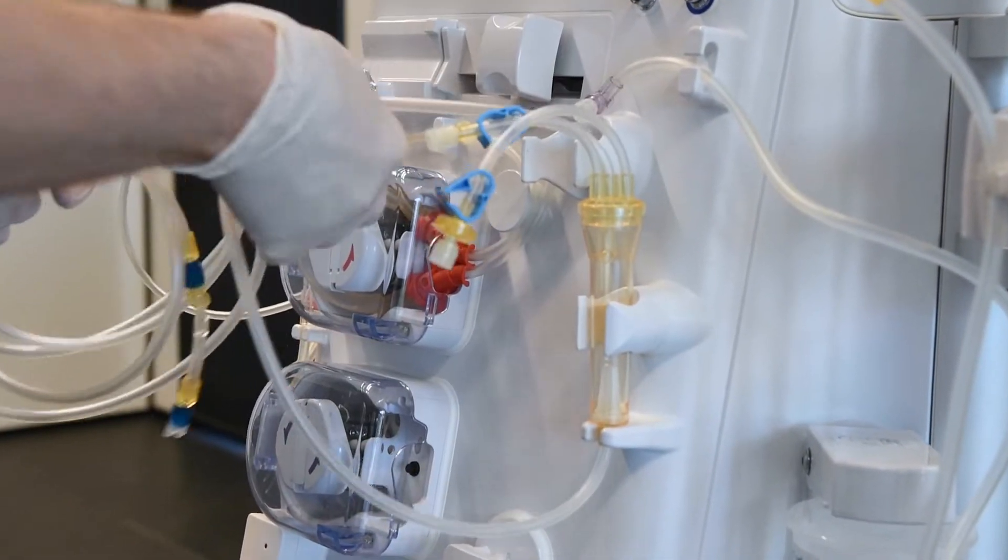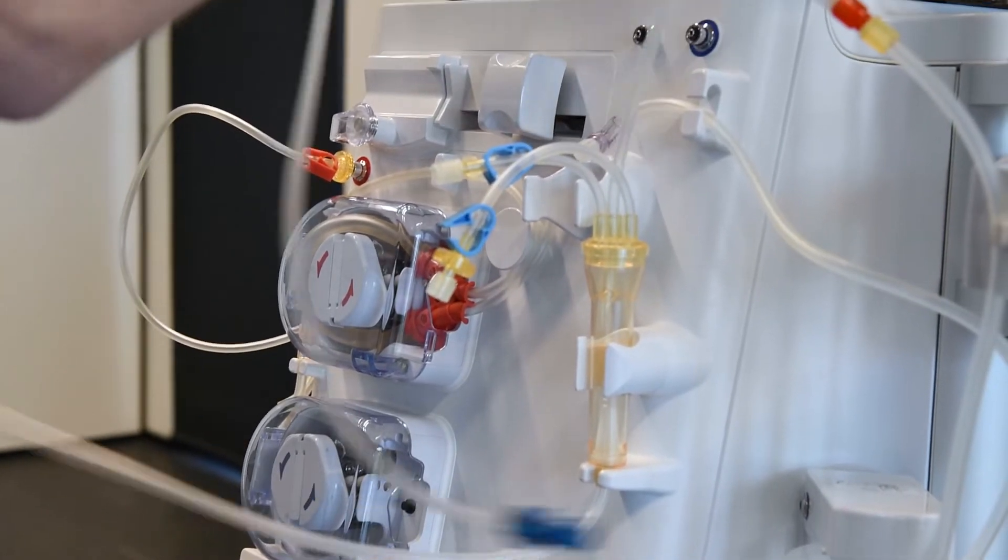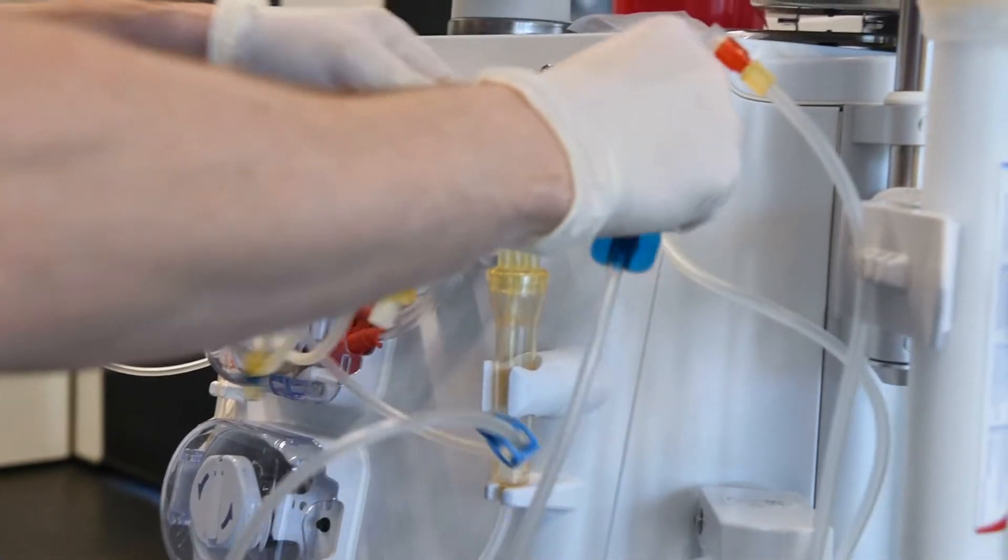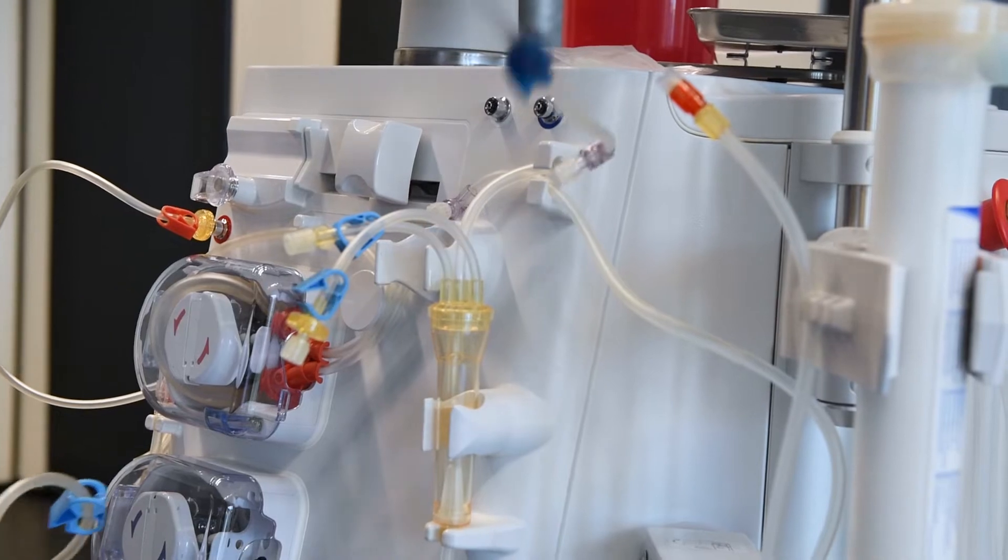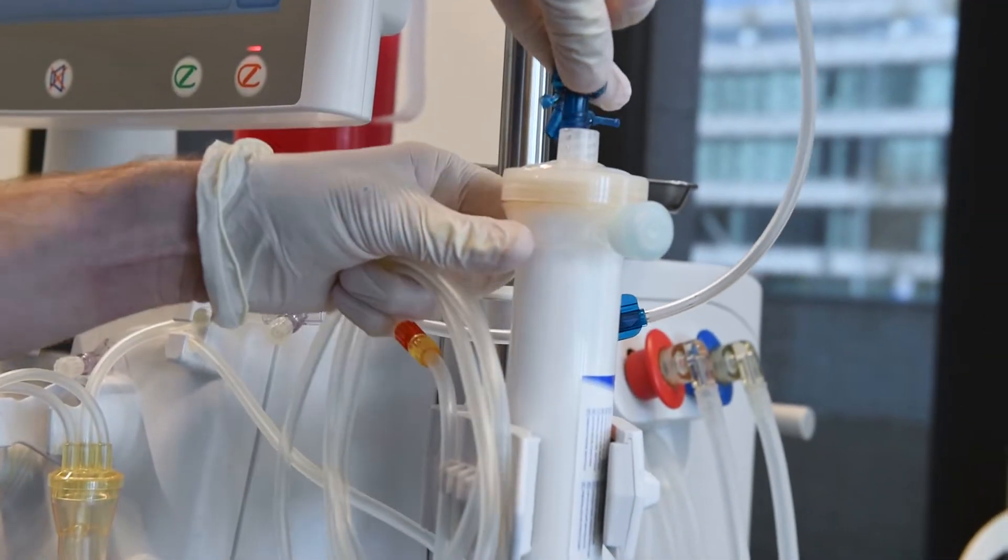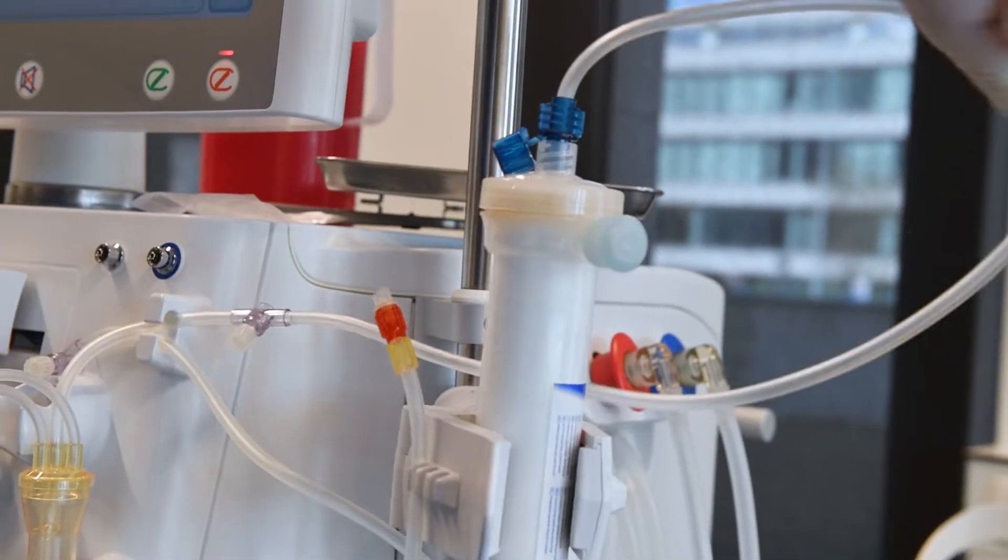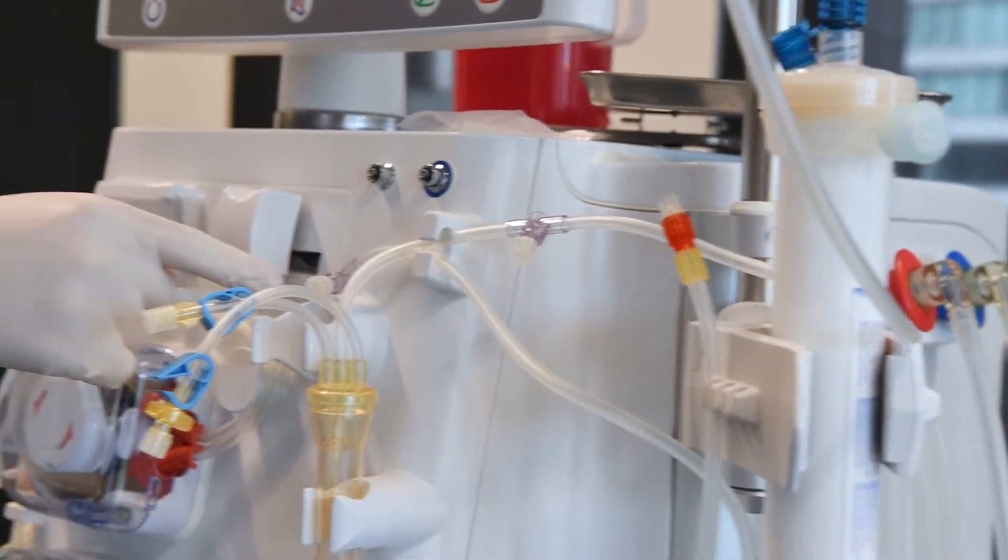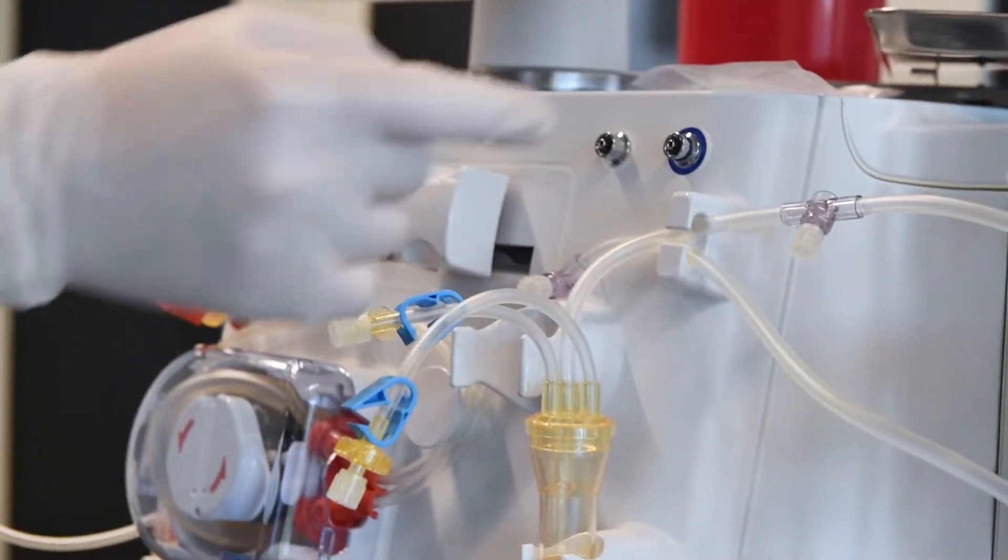Place the venous chamber in its holder and use the line holder for the bloodline leading to the dialyzer. This way you have easy access to the pre and post dilution ports.